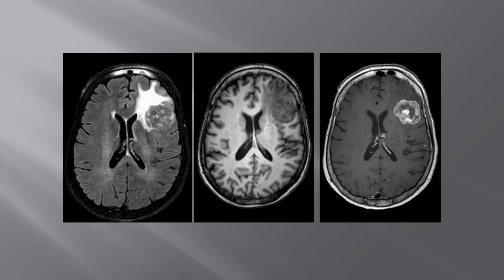Looking at our conventional maps, we have our T2 FLAIR. See a lesion here, kind of isointense, heterogeneous. T1, kind of iso to hypointense, again heterogeneous. Contrast enhancement, kind of a thick rind of contrast enhancement, fairly sharply marginated. Basically, you'd be thinking this might be a metastatic lesion, glioblastoma. A little thick rim, too thick of a rim for an abscess, could be a very unusual abscess, probably not.